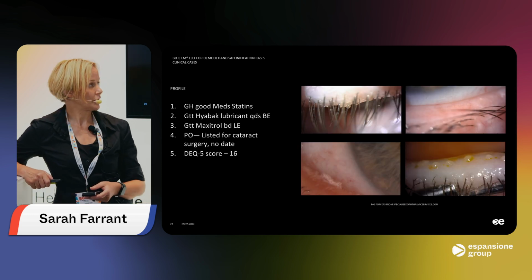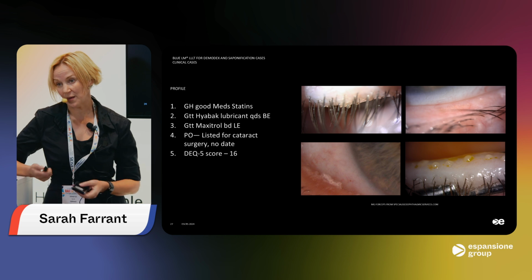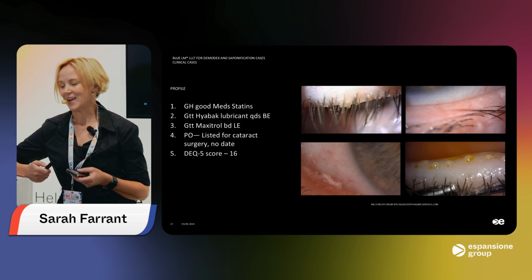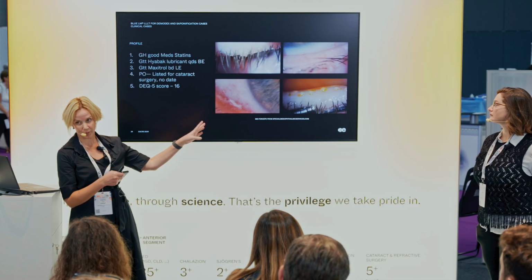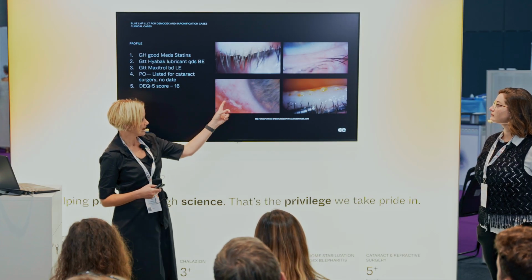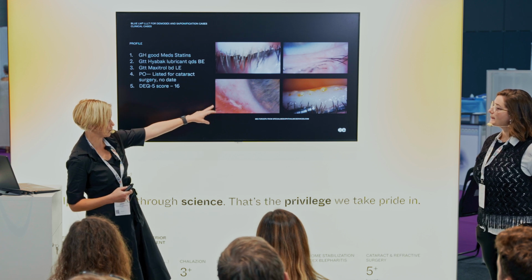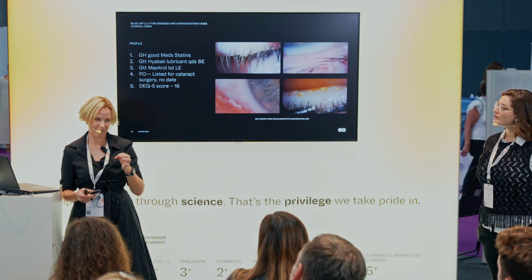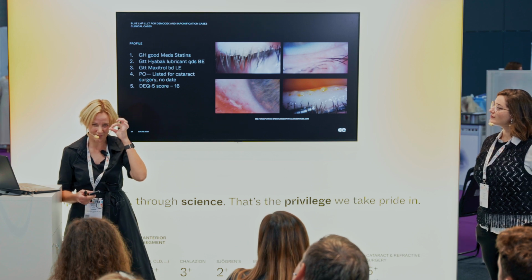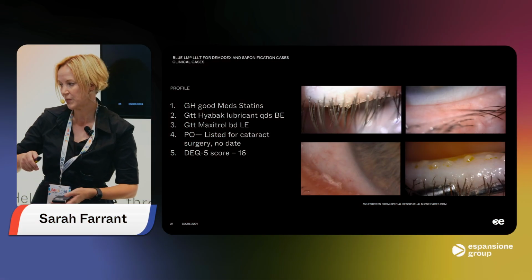So when we started to properly look at the issues that she had, quite a bit of Demodex Blepharitis, she had telangiectasia, she had gland dysfunction, as you can see on expression here, and she had, with me provoking nothing, just sat on the corner of her lid margin, quite a lot of saponification. She even had noticed it. She said, I get this kind of like little white bit of debris that builds up on my lid margin. And they do say that quite a few patients do notice it.